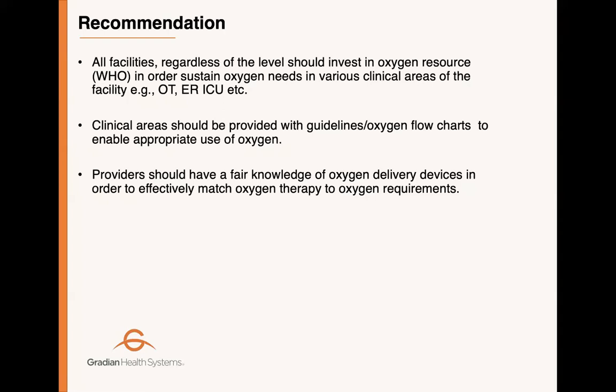And the other thing, I know Dr. Dati was coming to this, is that clinical areas should provide guidelines or oxygen flowcharts, just to serve as a reminder to providers on how they can go about recognizing a patient who needs oxygen, as well as choosing an appropriate oxygen delivery device.